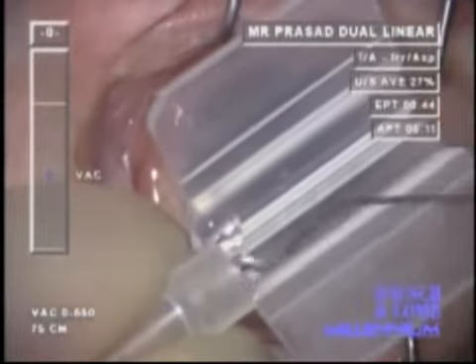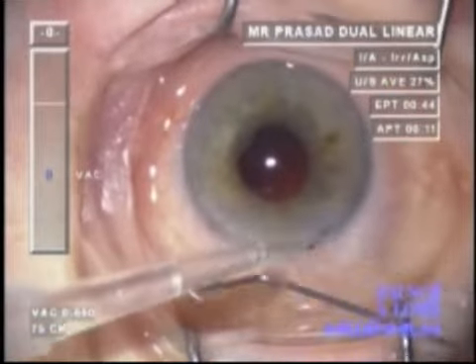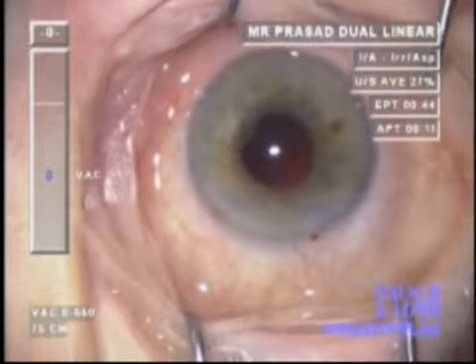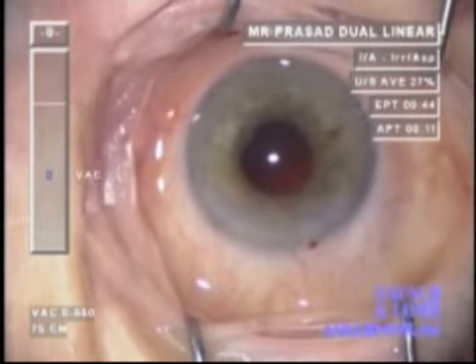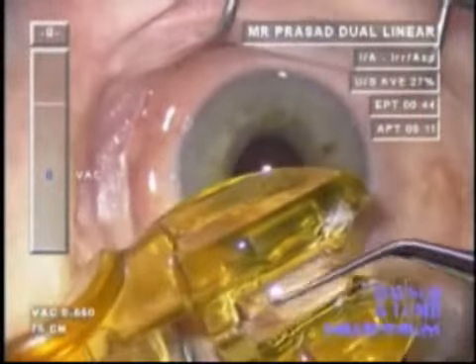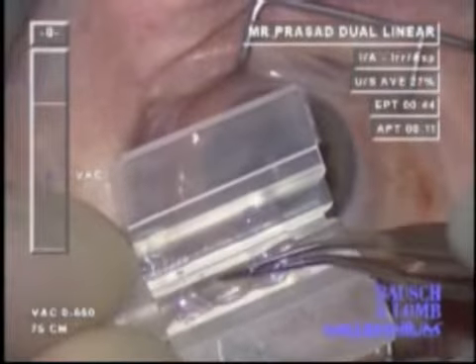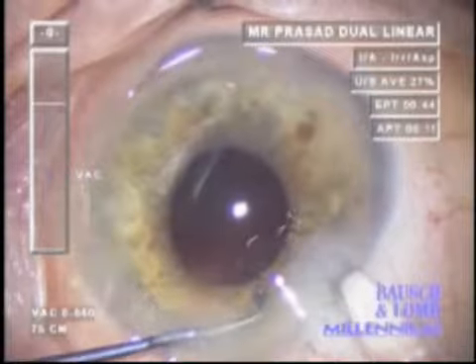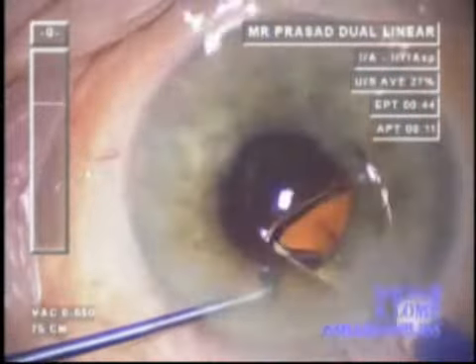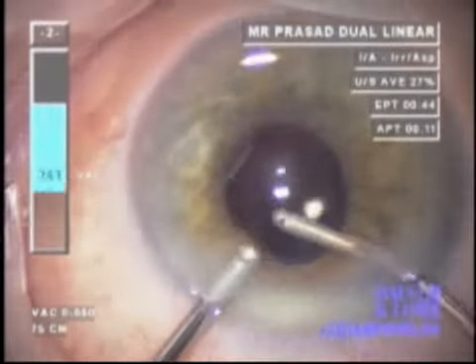The Viscoject 1.8 injector is used, pre-loaded with a small amount of viscoelastic. The Acreos MICS lens is removed from its holder and placed into the Viscoject cartridge, which is then closed and mounted. It is important to ensure all four small feet are tucked in so they are not snagged in the injector. A bimanual wound-assisted technique is then employed, with the second instrument stabilizing the eye and the injector engaging the incision without quite entering the eye.